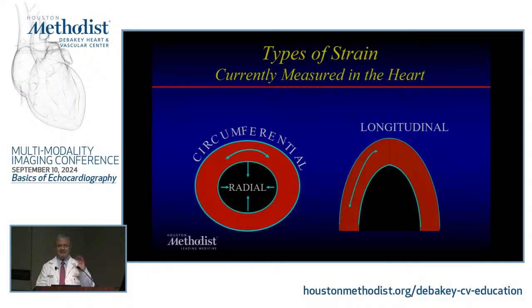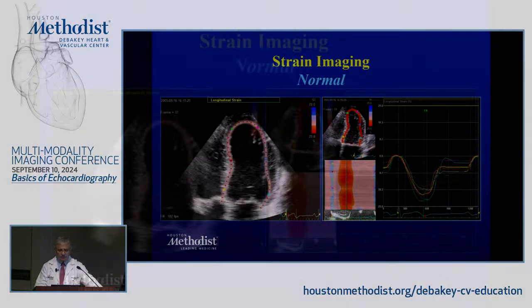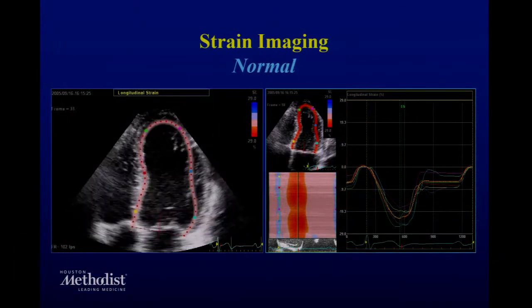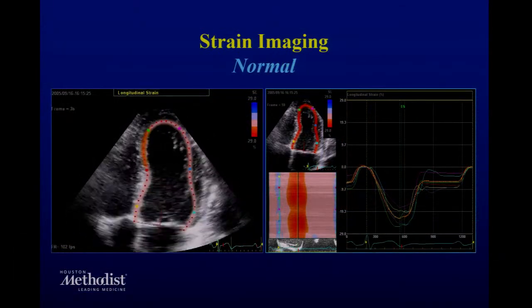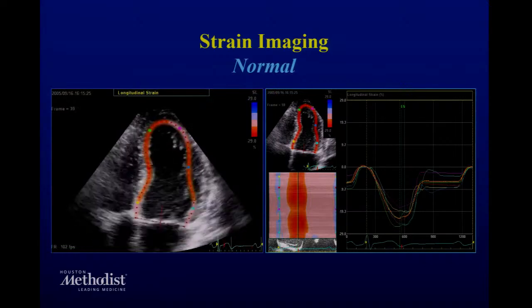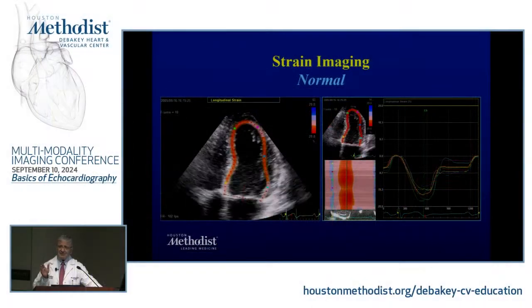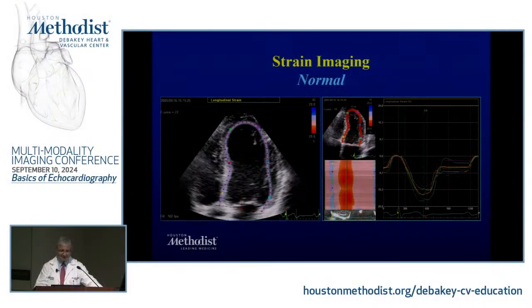But remember, it's a 3D rendering of what happened to deformation, relaxation, as well as contraction of the heart. And nowadays, all that is automated, which is really nice. It has its issues. At times, even if the signal is good and imaging is good, you can't rely on it. So in addition to artificial intelligence, you need your own human intelligence. Remember that, okay? Up till now, you always need human intelligence to take a look at artificial intelligence.